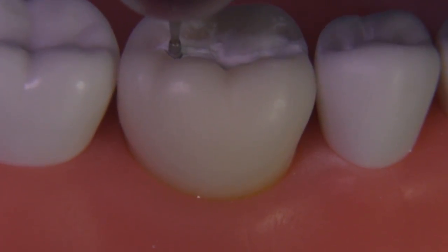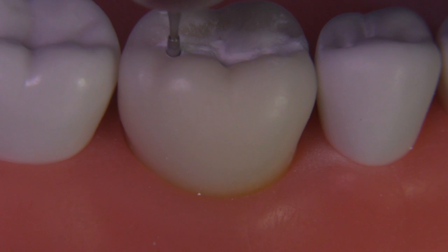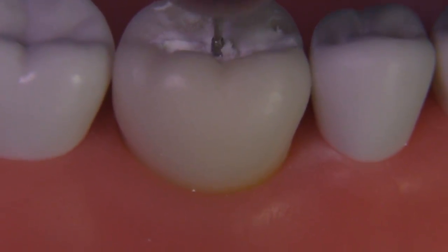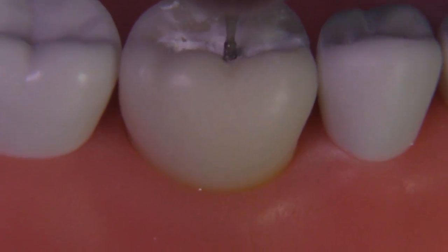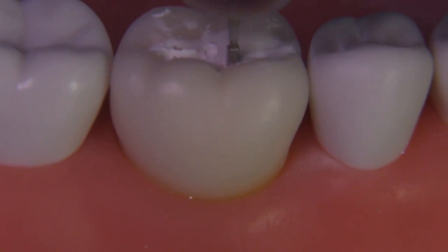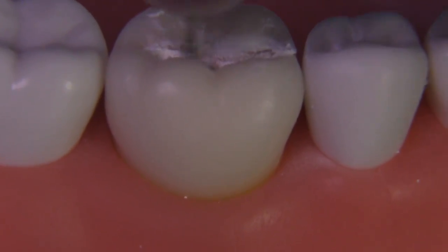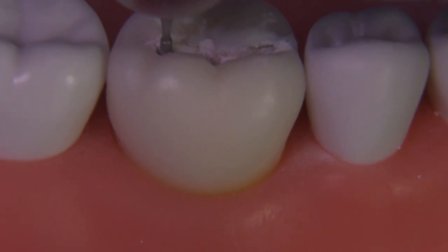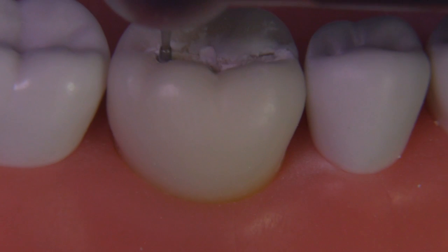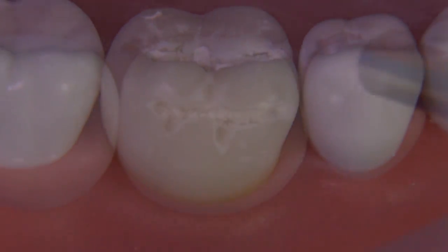We like to follow the primary grooves — that means any groove that is separating one cusp from another — and extend into these areas approximately a millimeter or so. If you're a half a millimeter or a millimeter and a half, it probably isn't going to make that much of a difference. Just extend so that it shows you know that is an area you would typically include.